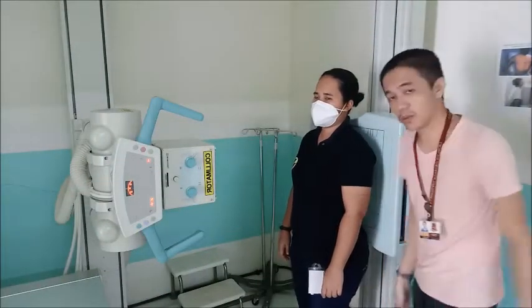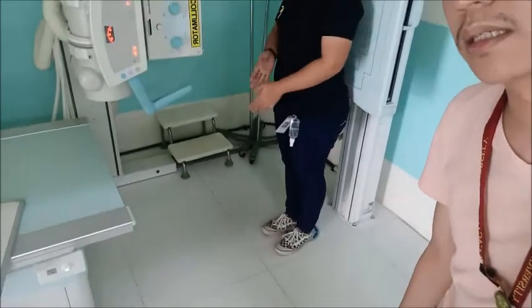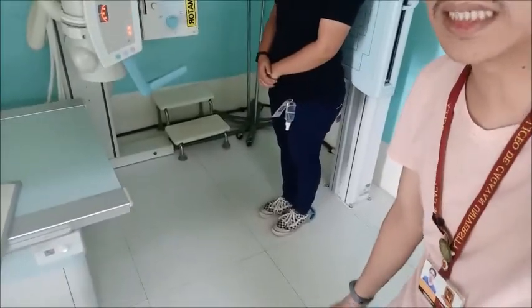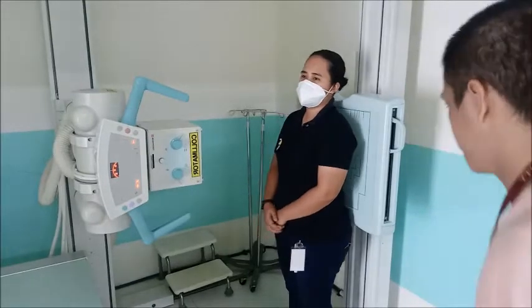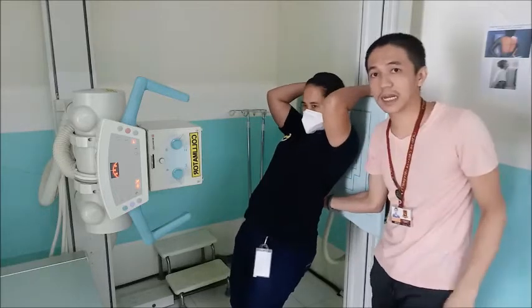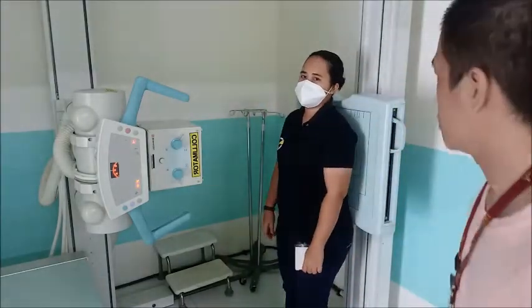Then ask the patient, as much as possible, ipahubo si patient sa iyahang shoes or sa iyahang slipper. Kay kung kabanta mo sa itong mga exercise facilities, naka-tiles. So if naka-shoes si patient, naka-slipper si patient, basig maligyas. Ipa-forward mo sa patient, tapos naka-tilt ang iyang body, so basig ma-slide si patient. As much as possible, again, ipahubo na ito sa iyang shoes.